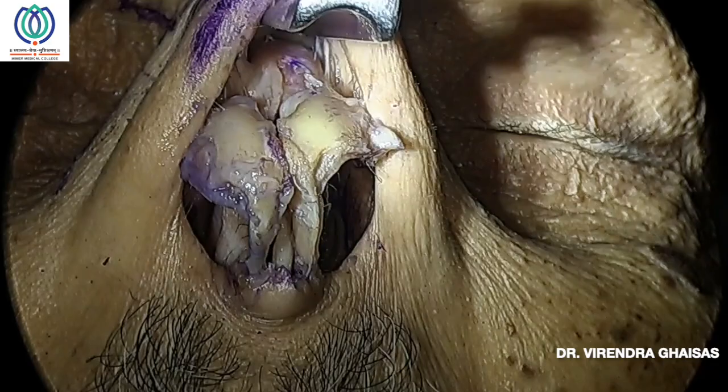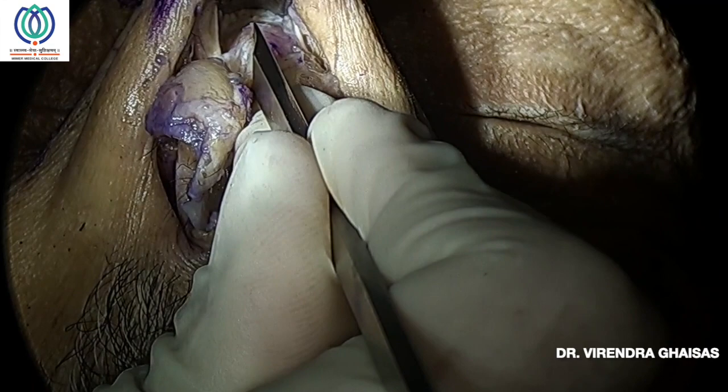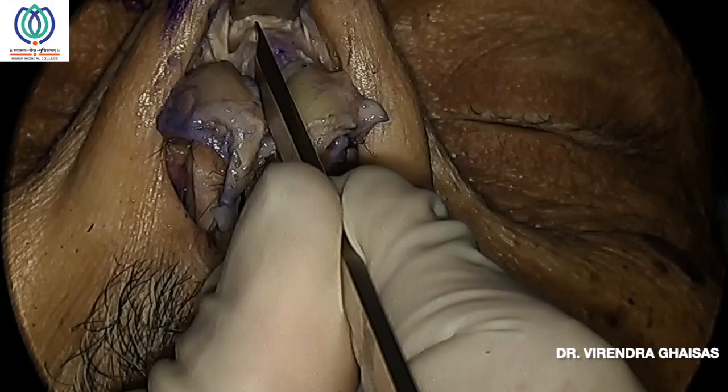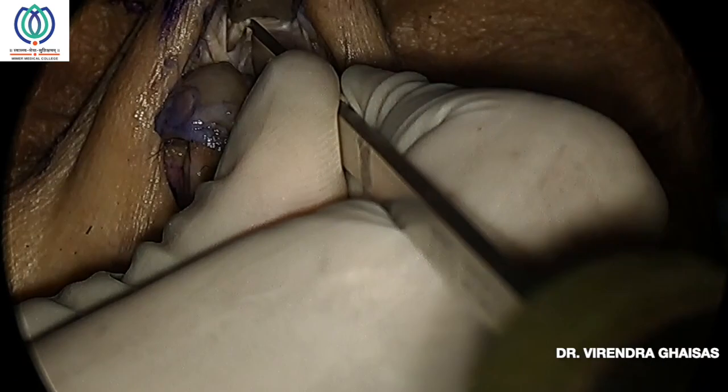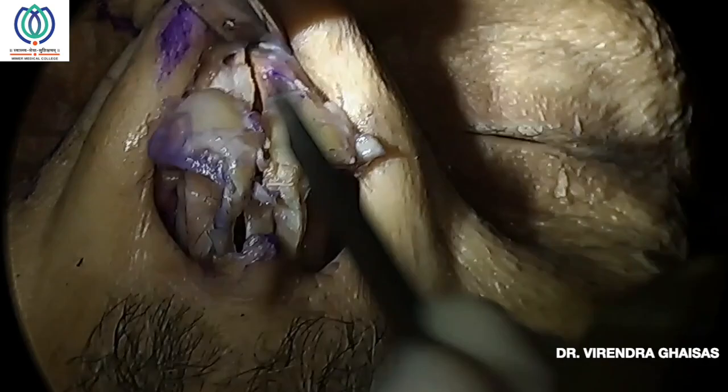The straight part of the 5 mm osteotome is toward the septum. It starts at the K junction in between the septum and the upper lateral cartilage. It's a straight line fracture that goes till the level of the medial canthus. Then the lateral osteotomy. Lateral osteotomy is done in two ways. It is done to fracture the nasal process of maxilla from the nasal bones.